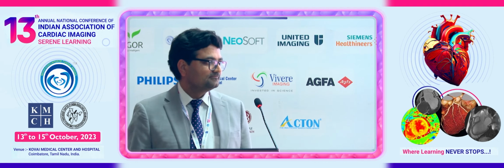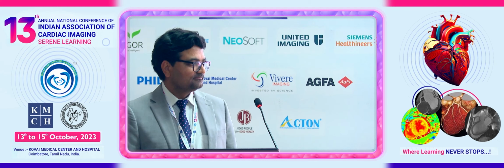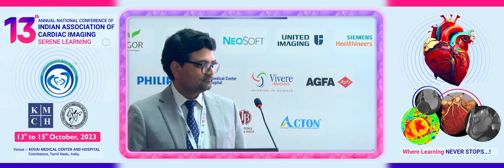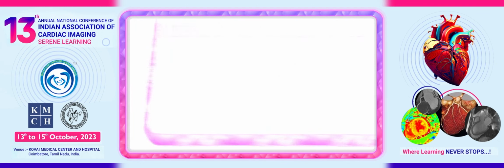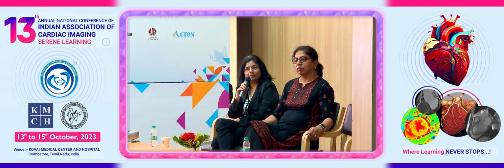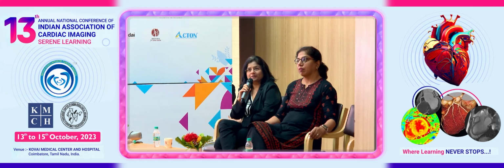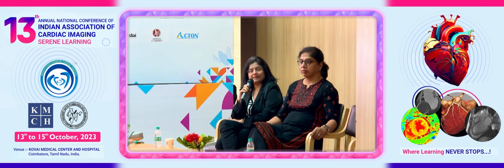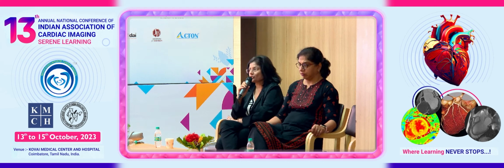Thank you, Vinit. That was excellent. That was really very well covered, and I think it's really new. TMVR in India is really happening only in a few centers. I just want the take-home message from this to be: remember one thing. While for most things I believe we should be doing it manually, this is one valve which you can't really size manually, because it's a saddle-shaped valve and a D-shaped valve, and we have to take the entire up-down angle into consideration when measuring. So you really need software here.